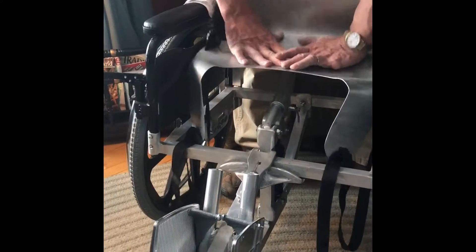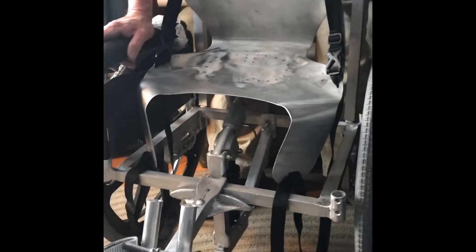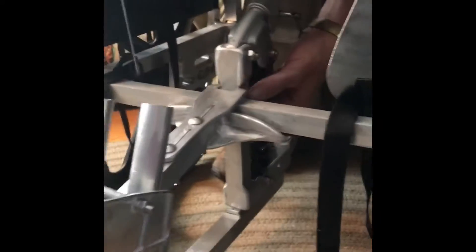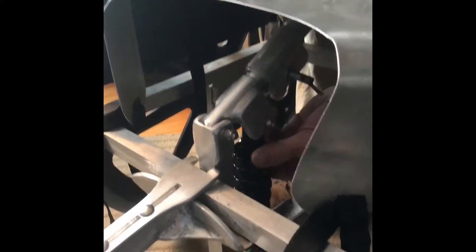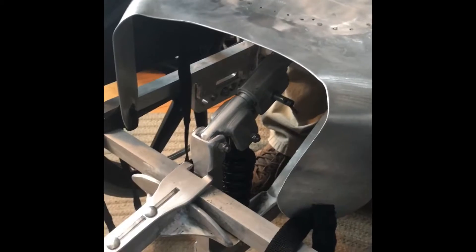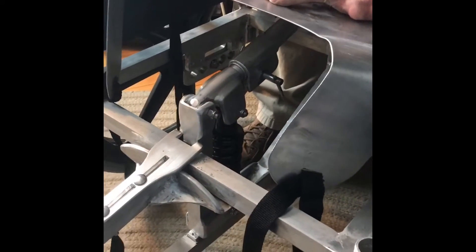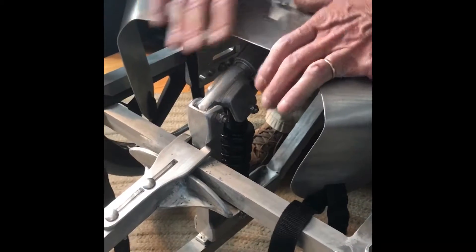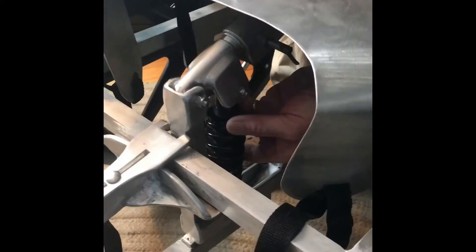It goes up and down — you see the height right here. Watch this, this will actually allow the seat to lower. See how loose that is getting? That lowered the seat substantially. The whole seat comes down, and then you can adjust the pivot to compensate for the height.